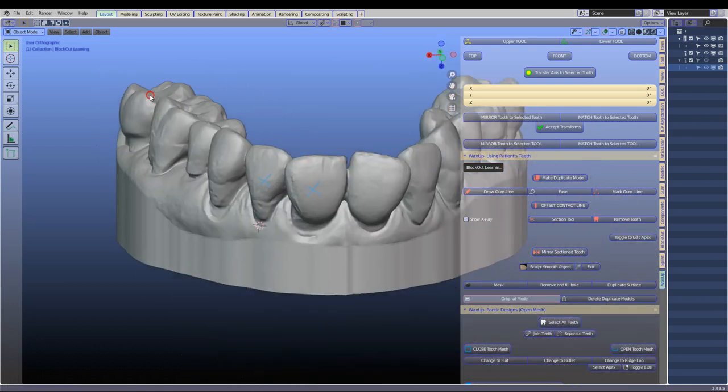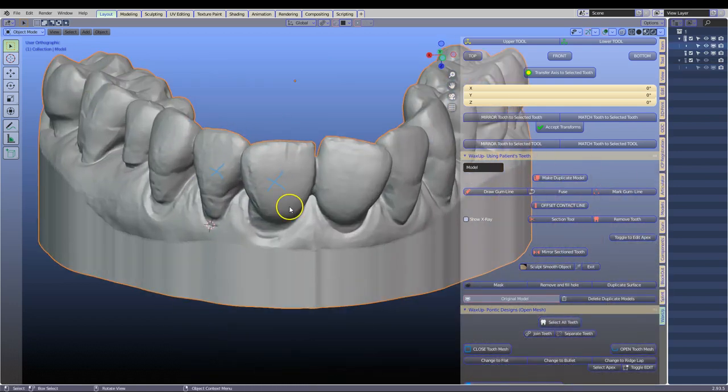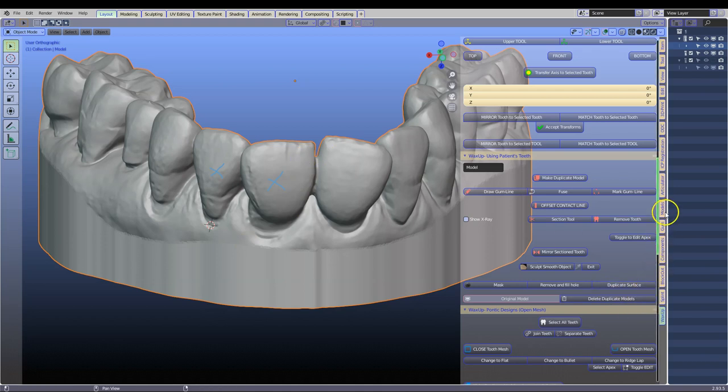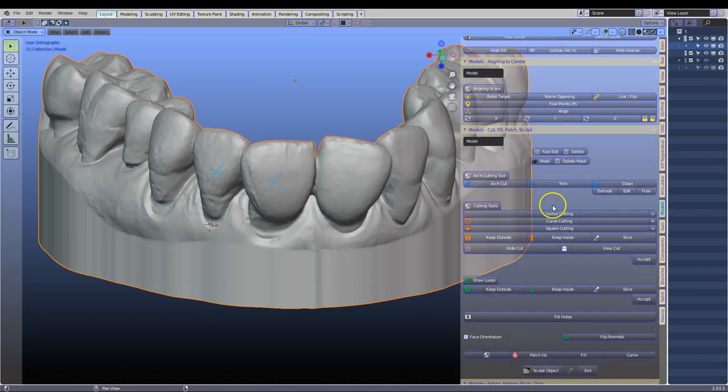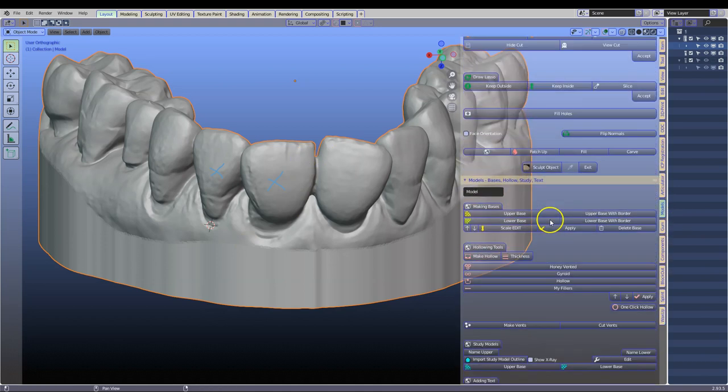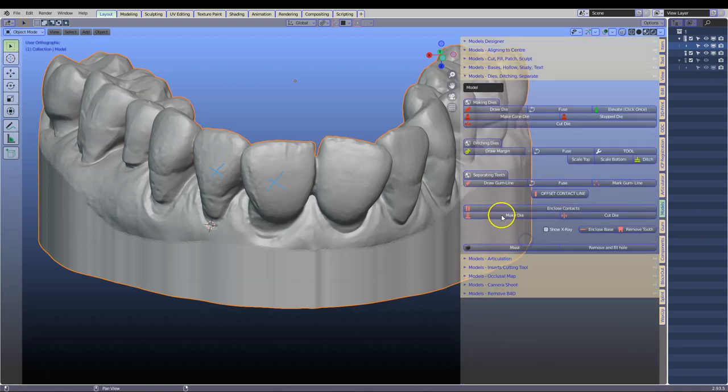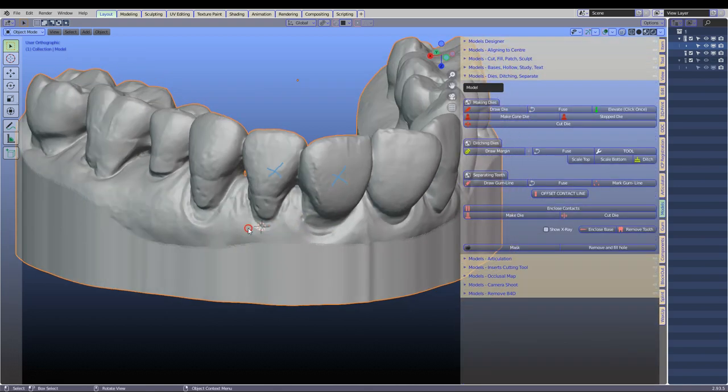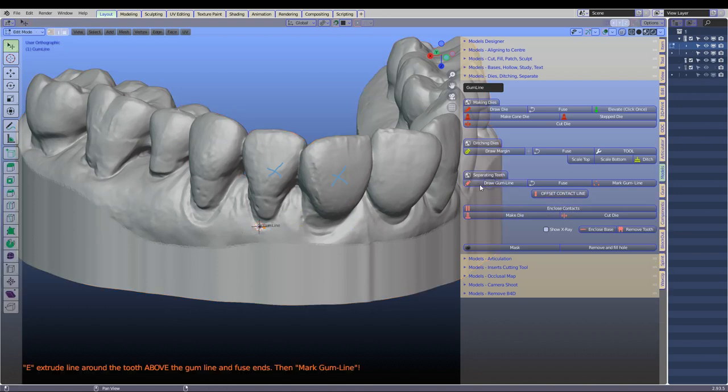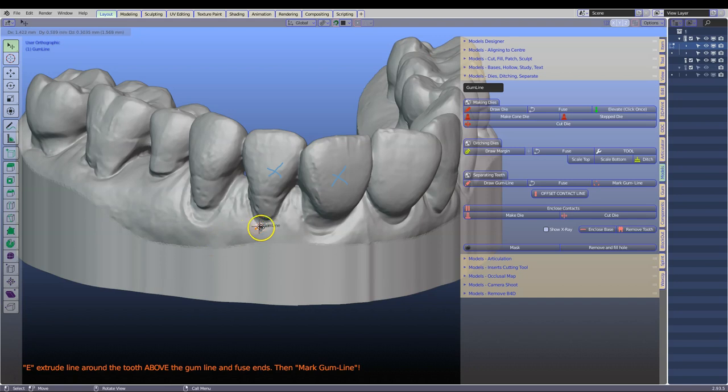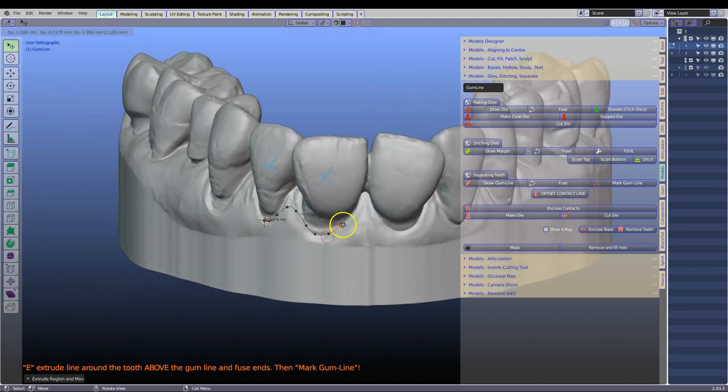I will go to the model designer after selecting that and we are going to go down to the culling tools here, the separate. First let's place our cursor then we are going to draw the gum outline. E, left click. E, left click and we are going to mark where we want to cut these teeth off.